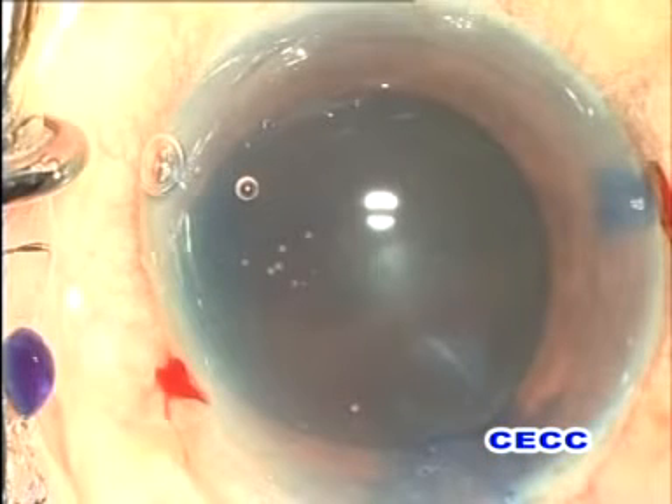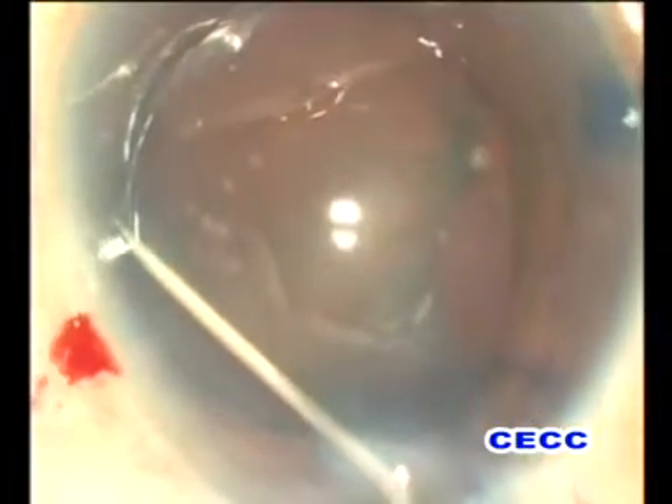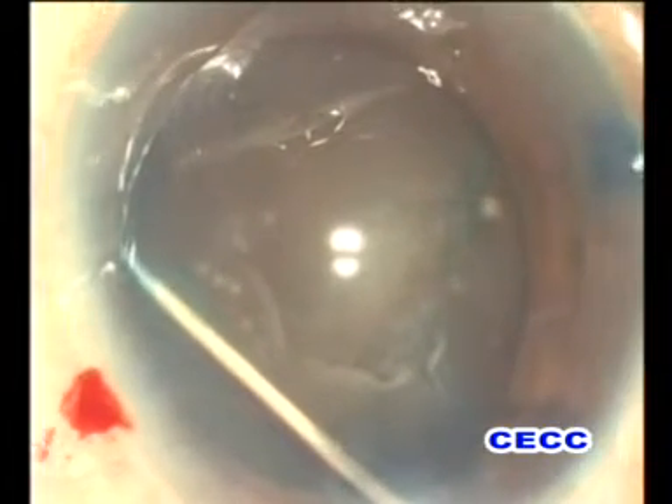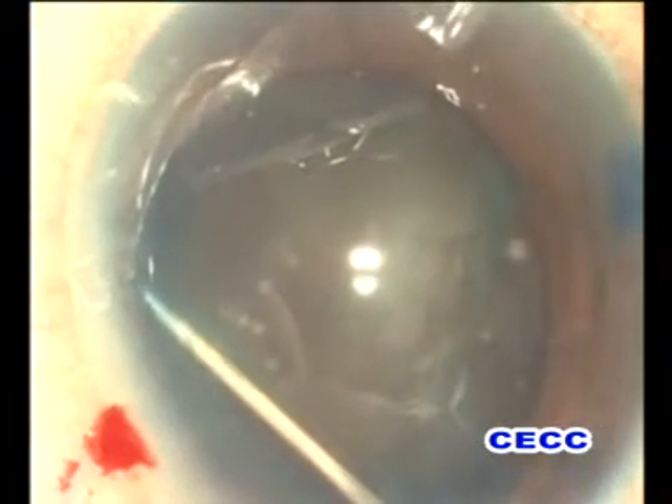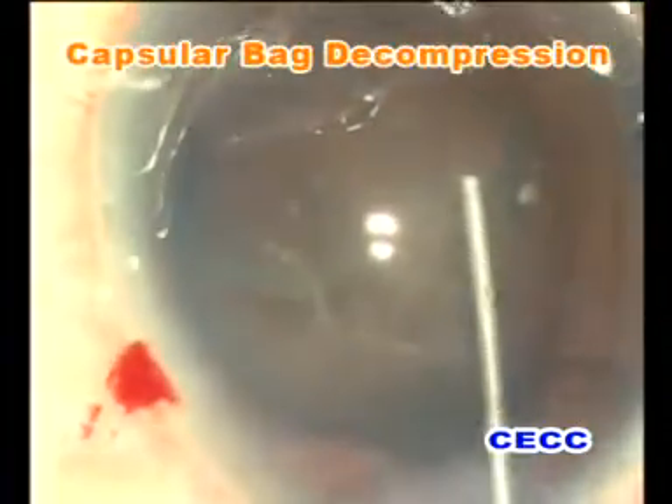The anterior lens capsule was stained with trypan blue dye to improve the visibility of the rhexis margin, which is useful for subsequent direct chopping maneuvers. A 5 to 5.5 mm anterior capsulorhexis was fashioned, which is a desirable size for hard cataracts. Meticulous cortical cleaving hydrodissection is performed to mobilize the nucleus.